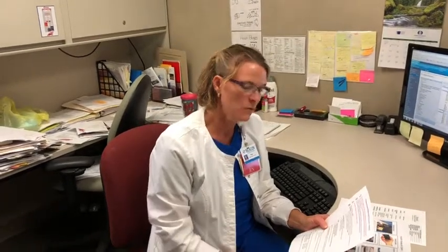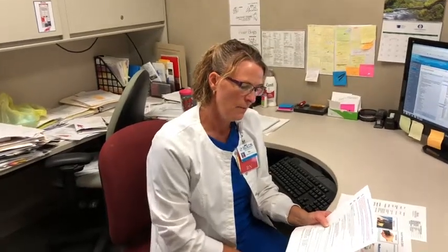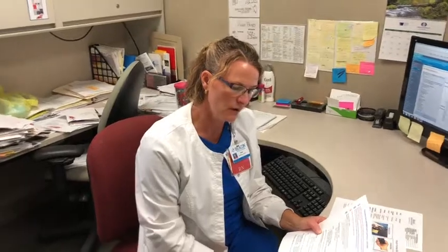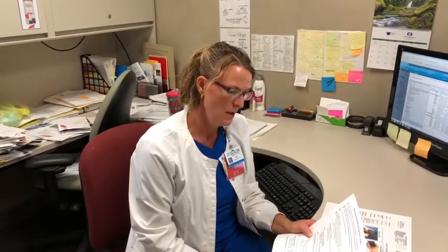Side note, there is supposed to be a temporary disconnect or a suspend to unhook it if a patient is going to PET scan, MRI, IV pyelogram, or any nuclear scans, but you don't have to remove that separate cannula site. So when they come back, you can reconnect them. And so once they get back from the procedure, you want to promptly reconnect it and restart the insulin. If it's over an hour, they need alternate insulin because it's rapid acting insulin, and especially type 1s can go into rapid DKA.